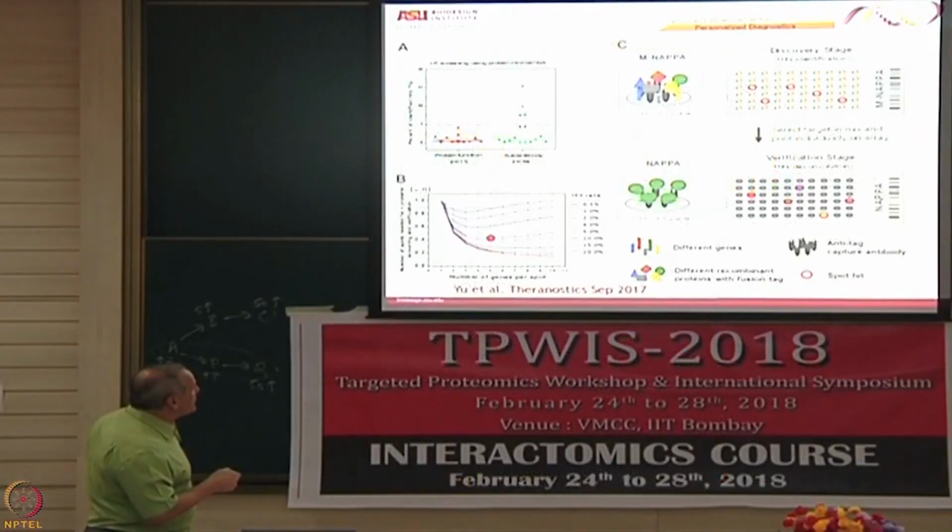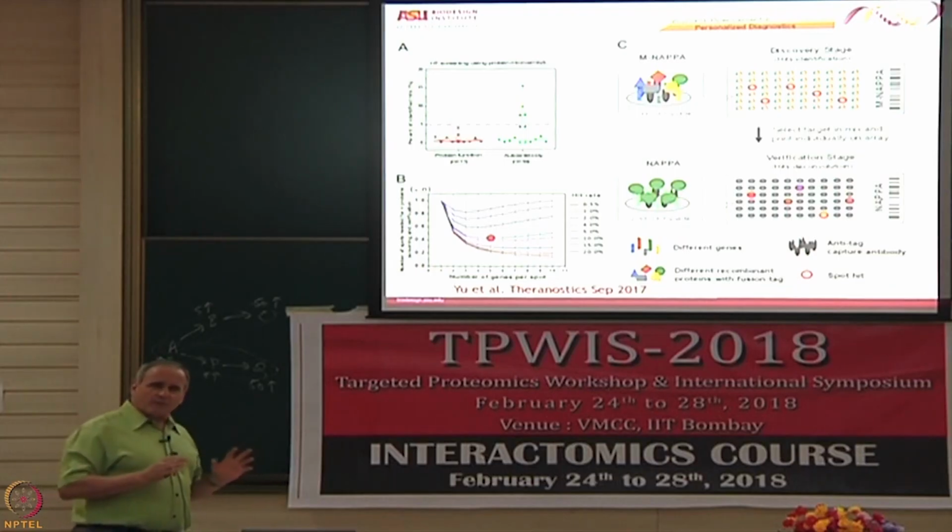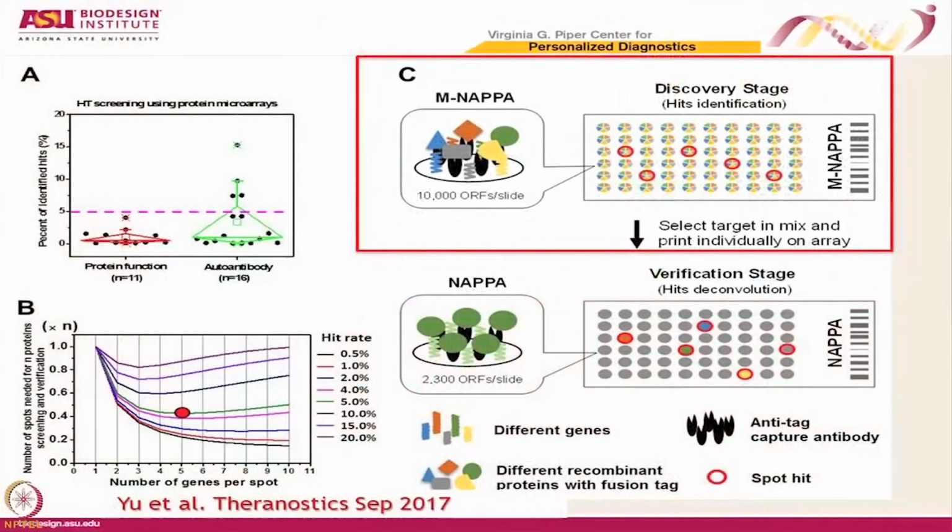These guys are also pretty good at 5. When you get up to here, when you get up to 10, 15, 20% response rates, you need maybe to question whether the strategy is a good one for you. Does that make sense?